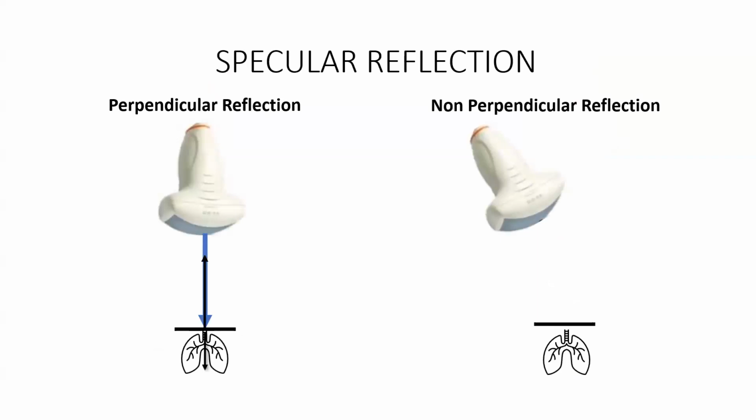Very similar kind of concept. Now, what is very important from our perspective is this concept of angle of inclination. When you're doing Dopplers in particular, it's really important that your probe has a very small angle between the blood vessel and the incident wave.